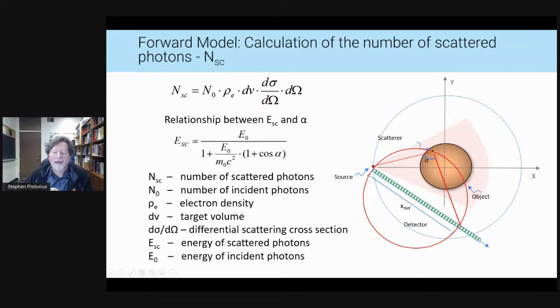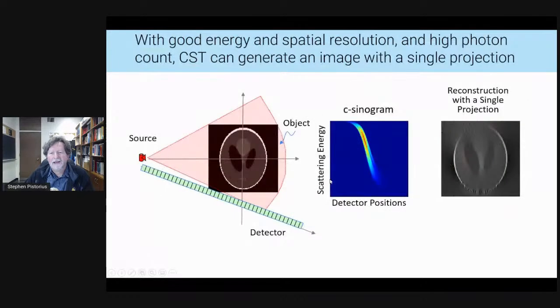And so unlike traditional CT and positron emission tomography, where the reconstructions are done along straight lines, our work typically uses reconstructions along curved arcs. Now, the nice thing about this approach is that it gives us some additional benefits. And because we're now detecting both energy and position rather than just position, we can get away without as many positions of rotation around the patient as we would typically need.